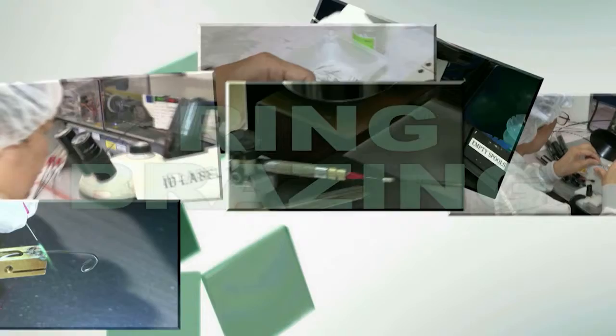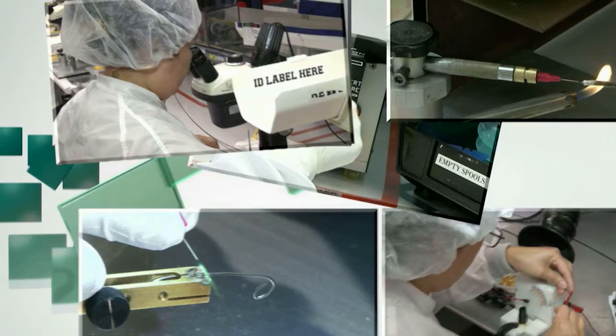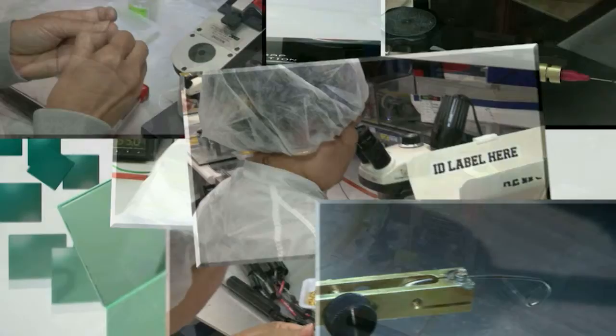Ring brazing is an important step in the manufacturing of catheter assemblies. Doing it correctly requires skill and care. Correct brazing will help create a product that is effective and safe for patients.